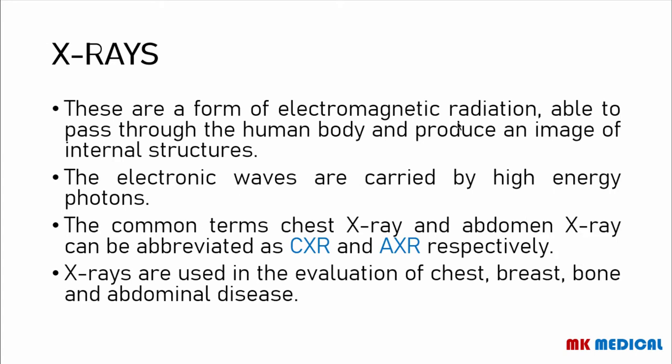So remember that X-rays are simply a form of electromagnetic radiation, and this electromagnetic radiation is going to pass through the human body and produce a picture or an image of the internal structures on a film. Remember that these electromagnetic waves are going to be carried by high-energy photons, meaning that they're going to be penetrating into the tissues. I want you to keep this in mind, because often people have this misconception that the X-ray film starts off as a dark piece of paper and then becomes white, but it's obviously the other way around. It starts off as a white piece of paper, then becomes dark.